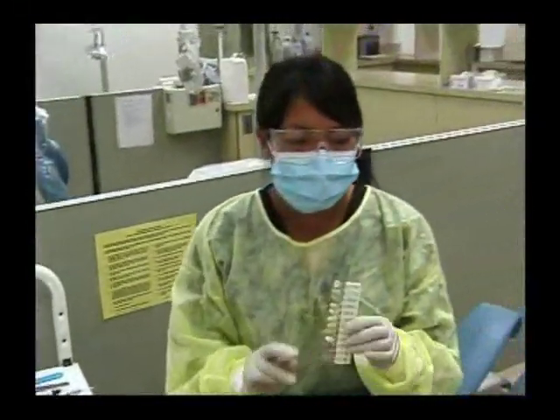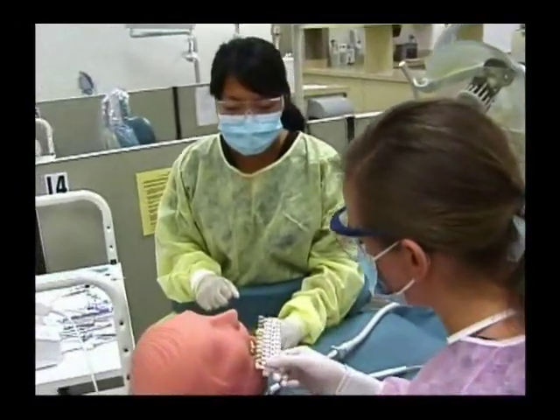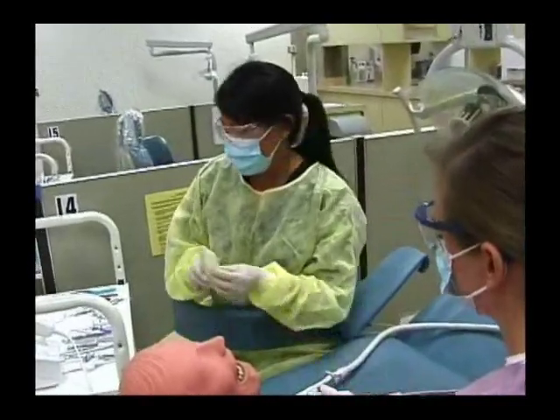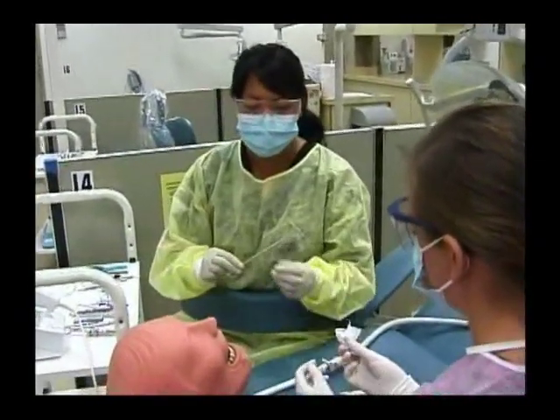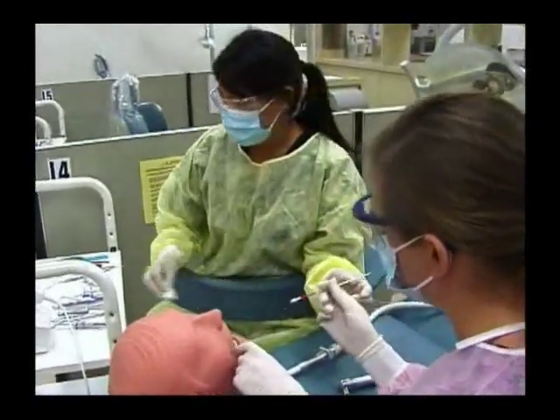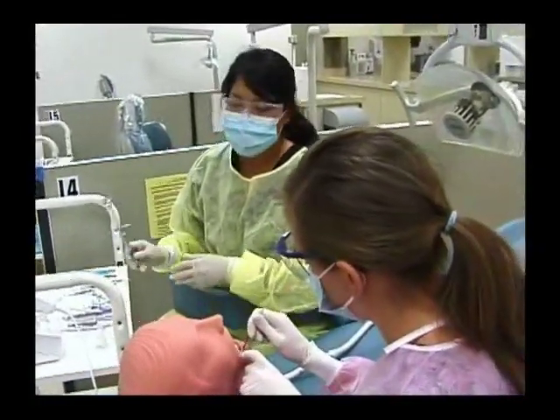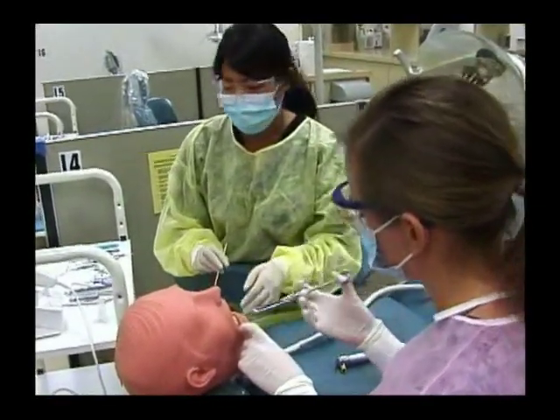First, you take the shade guide to match it to the tooth. I think 55 will do. Then you need to place a topical anesthetic and then use the aspirating syringe to numb the area.